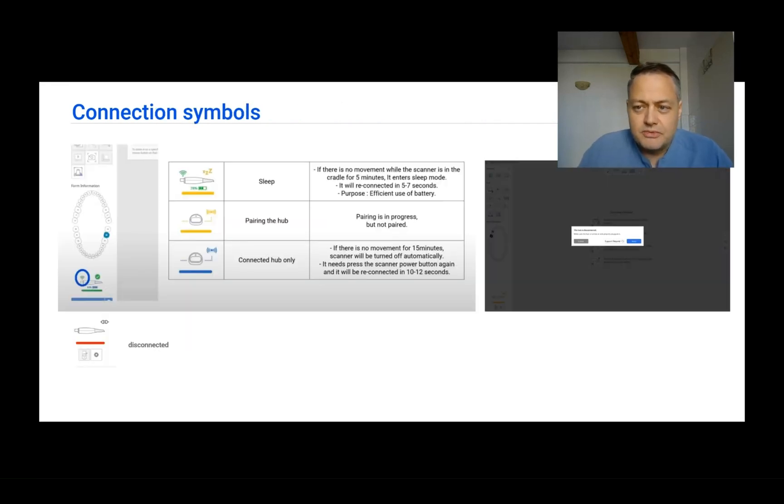Once the scanner is connected to the laptop for the first time, it's going to go online and bring you the activation key for the scanner. So bear in mind that when you want to first use the scanner, your laptop needs to be able to connect to the internet.